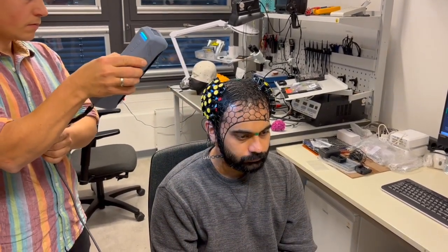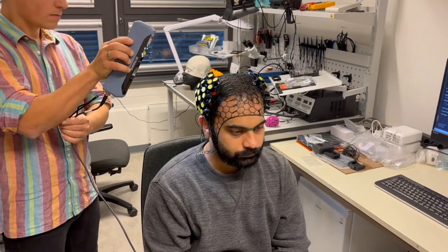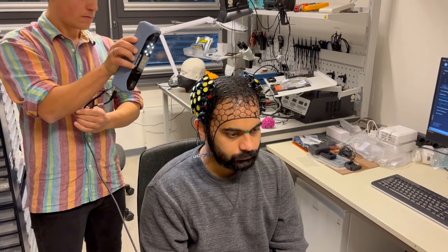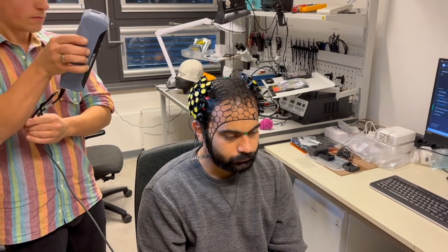In difficult regions, like here at the optodes, pan and tilt the scanner carefully to capture everything from all angles. Make sure to have good quality everywhere, but try to be quick. Taking around 3 minutes per scan gave the best results. If the scan lasts too long, the risk of distortion by head movements is increasing.